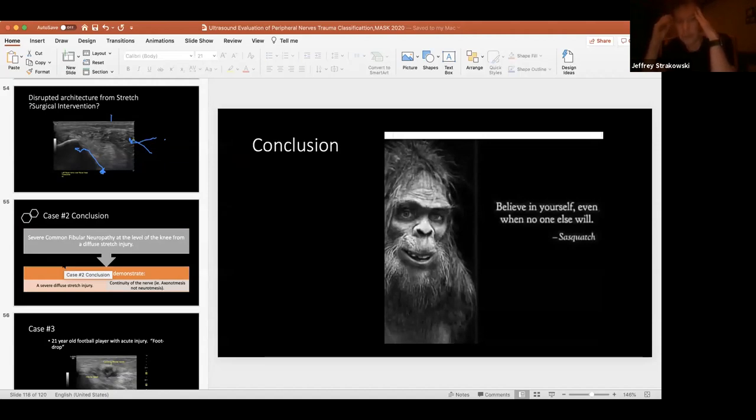So what we're really measuring is the volume of nerve fascicles, what's inside the epineurium. So I'll just make a picture. If the median nerve is like this and it's all within one epineurium, more proximally in the forearm, we would measure inside that epineurium. When it branches, and what a bifid means is just that it's branching earlier than it normally does. For example, a lot of times what that bifid is, it's the common palmar branch of the third web space coming off early. That's what it is in most people. So now you have connective tissue and other things in between those fascicles, and you don't want to measure the whole thing because it's not going to be accurate. You're not measuring the same stuff. So when it's a bifid, you measure inside the epineurium in one, measure inside the epineurium in the other, and you add them together. And that's how you do it.